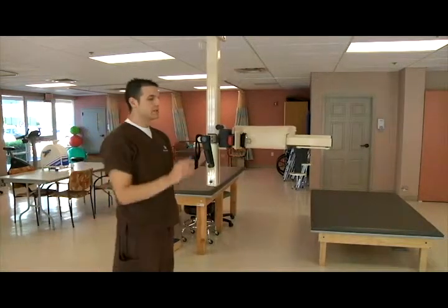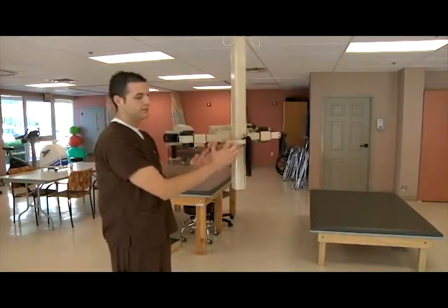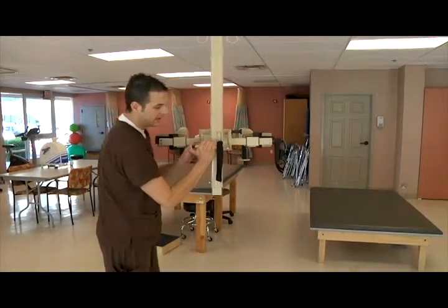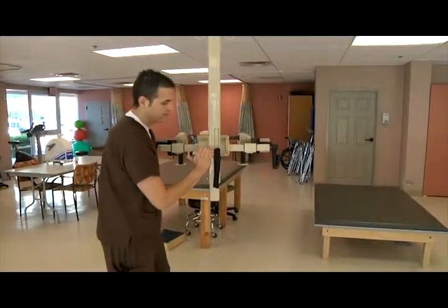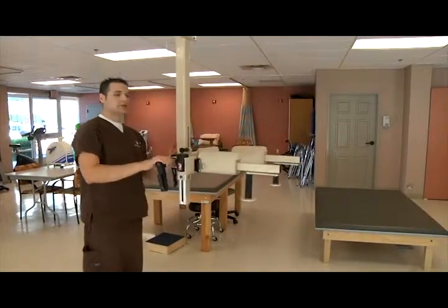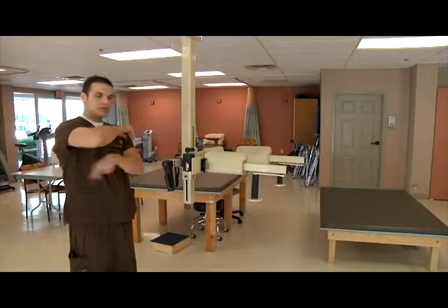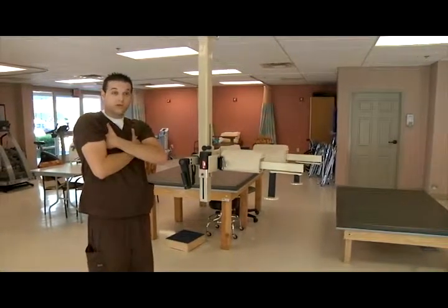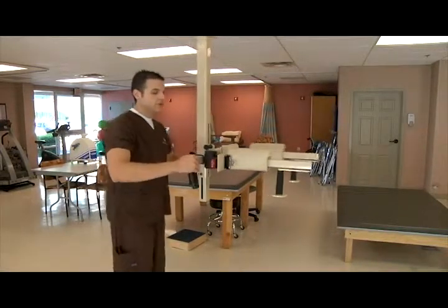What we're going to do is come around to this plunger here, okay? We're going to push down on it. When we push on that and pull down, it's going to allow us to adjust for the patient's height here, okay? Ideally, you want to put this in the patient about 2 inches or at least 2 fingers underneath the armpit. This way we're not putting too much pressure underneath the brachial plexus. And we're going to lower this just a bit.